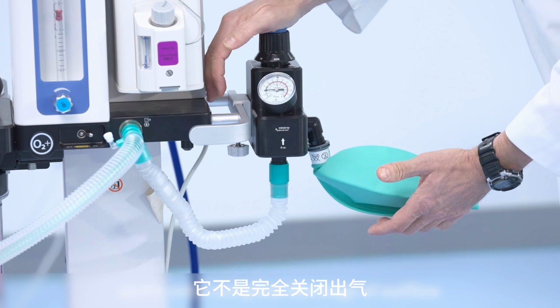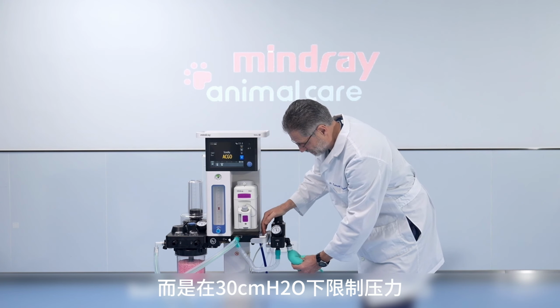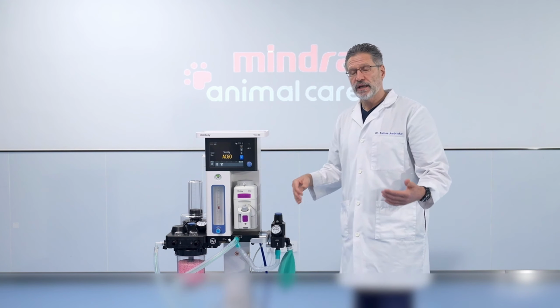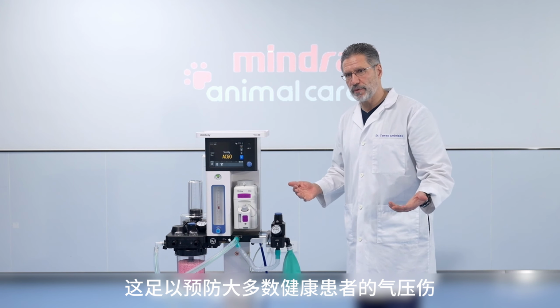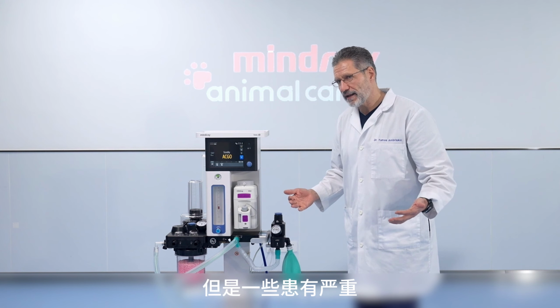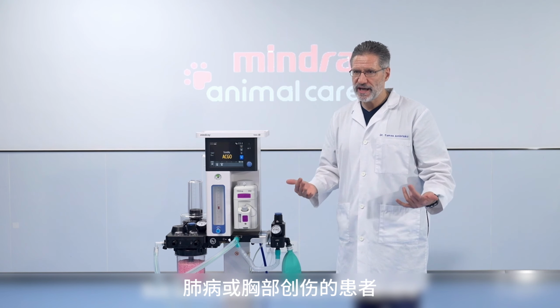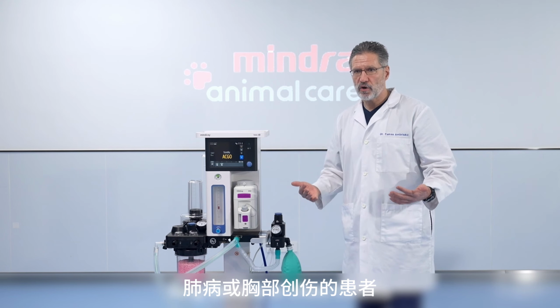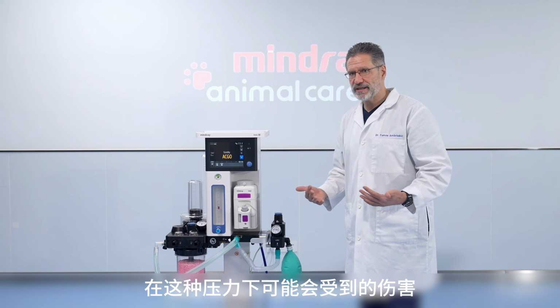So it's not a complete blockage of outflow, but the pressure is capped at 30 centimeters of water. As I told you before, this will be enough to prevent barotrauma on most healthy patients, but some patients which have severe lung disease or chest trauma may be hurt by this pressure.